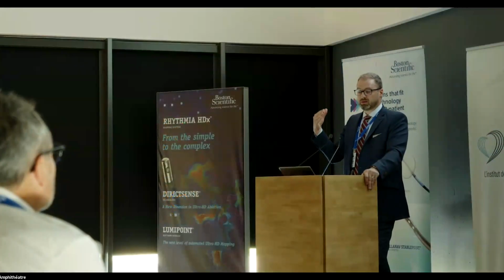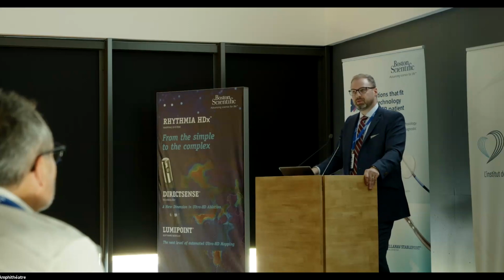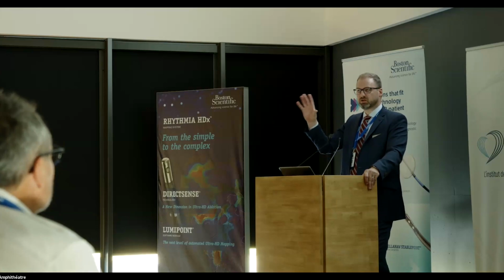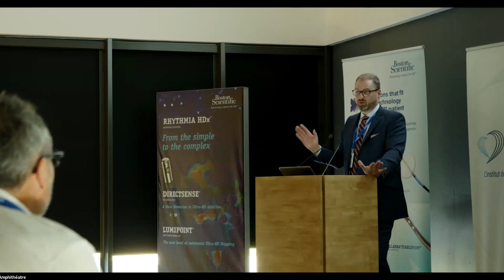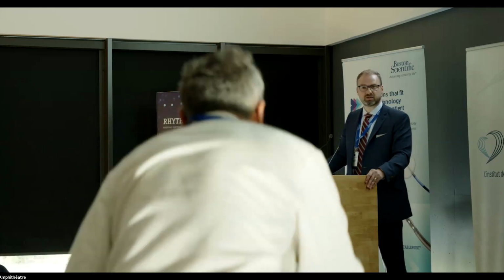So even if we talk about posterior wall, which by the way is off label until we have indication for that. But if somebody, in the future, as we study this in our studies, when we're looking at posterior wall, it's really not posterior wall isolation, it's posterior wall ablation. Like you're literally taking out the entire wall because you have this spatial, volumetric ablation that's quite large. And then as you change the field, you can, at the local level, have a different effect on the cells. So for right now, that's all I had for you. Certainly happy to entertain any other questions.